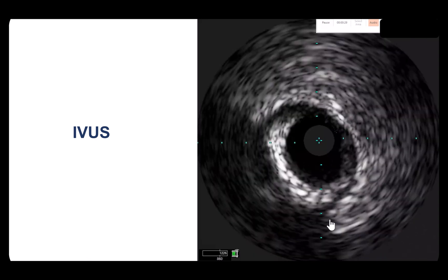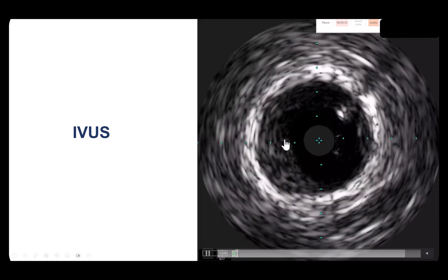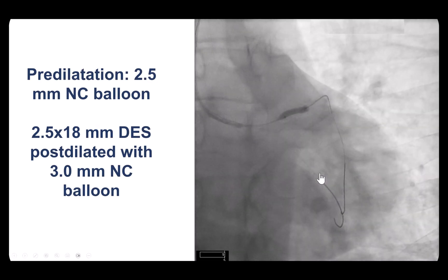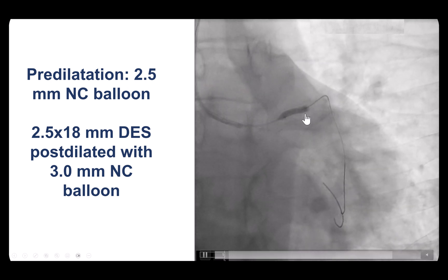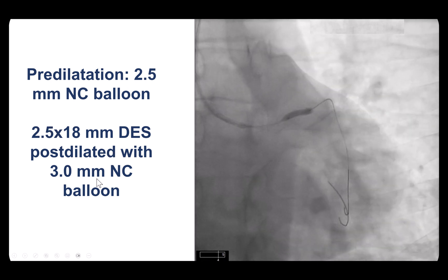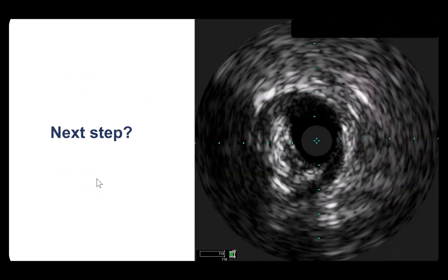There is also some plaque at the ostium of the LAD. The vessel was predilated with a 2.5 mm balloon, which one might argue might be a little undersized given the intravascular ultrasound findings. Then a 2.5 by 18 mm stent was deployed and post-dilated with a 3.0 mm balloon. Then IVUS was performed.